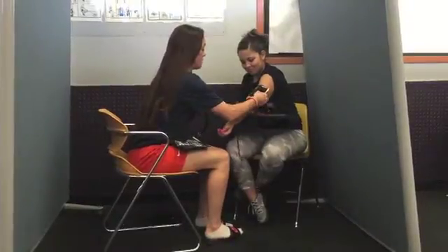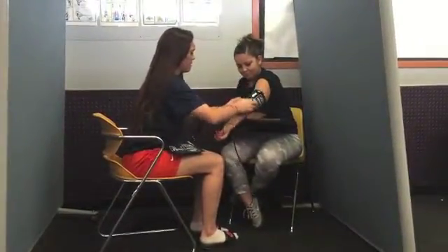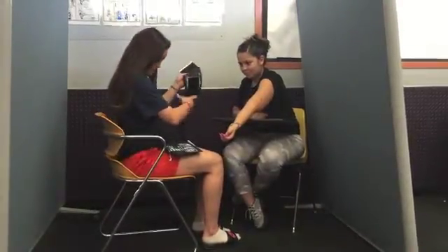Make sure the patient's feet are on the floor and back is supported. Make sure the cuff size fits the patient properly. It should be tight and snug, not loose and not too tight.